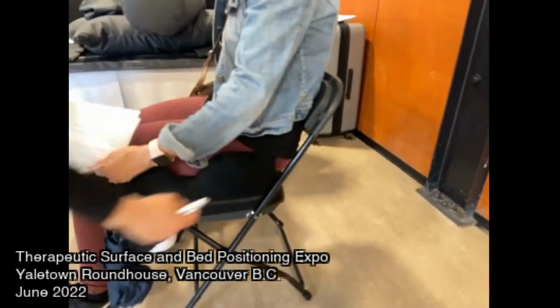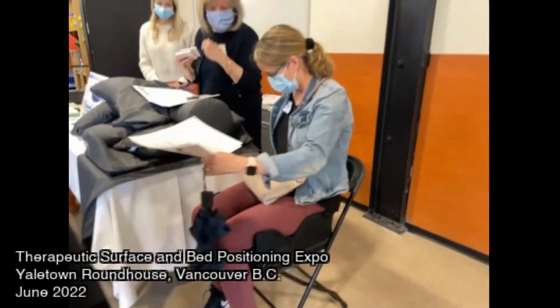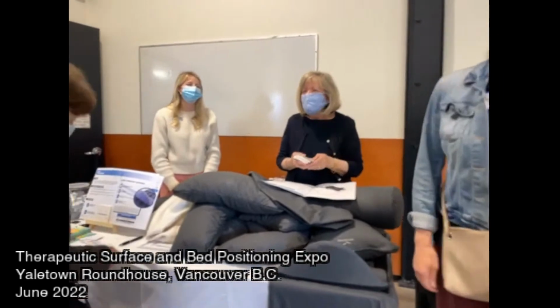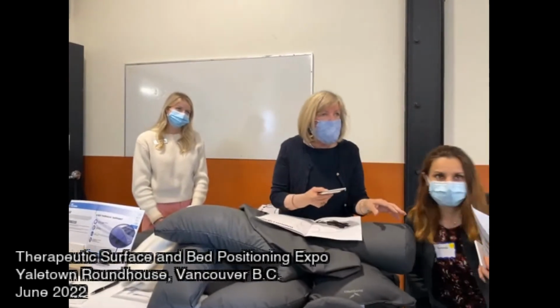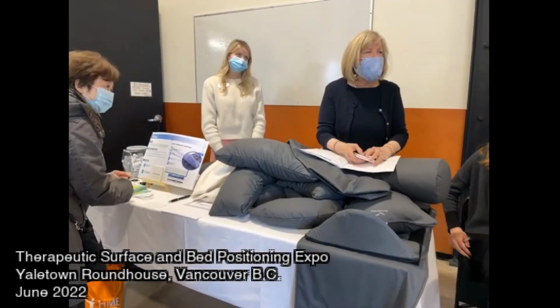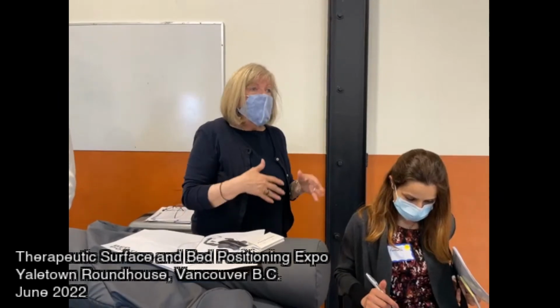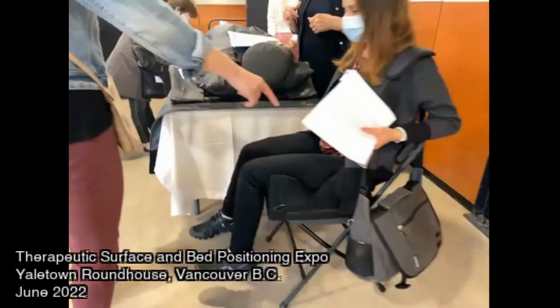It's hard in that it's not flat, but put it closer to your 18. You can also get it without the rear pelvic support, and it's a lesser amount. What is the purpose of the support? It's where they sit, in a size that, say you were an 18, or maybe a 17 would be fine. Does that fit you, the 16? To have the support, yes, I'm 16.